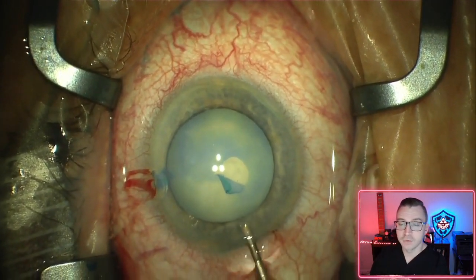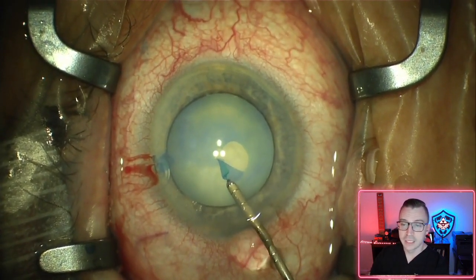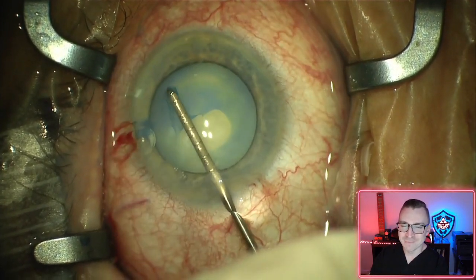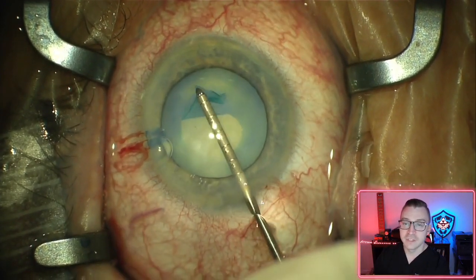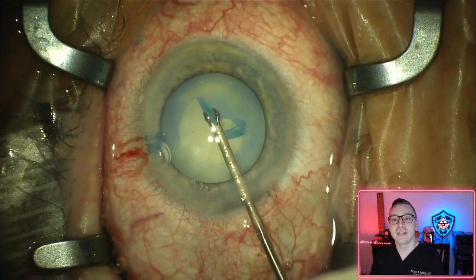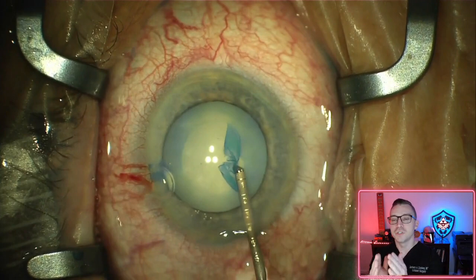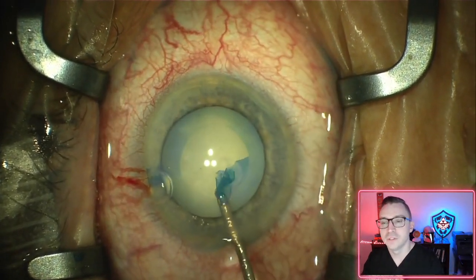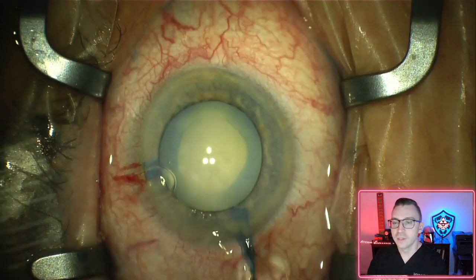It's actually this part of the surgery for these really mature cataracts that can be kind of stressful, anxiety-provoking, whatever you want to call it, because sometimes these cataracts are so large that they're under a lot of tension, and they're pushing with such force on that capsule that the moment you go in there and make that little tiny tear, that pressure just splits the capsule right open. And when that happens, you've got a bigger headache to deal with on your hands. Not the end of the world, certainly, but it is a bit more of a headache to deal with.